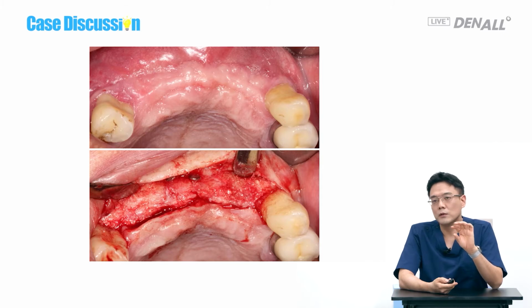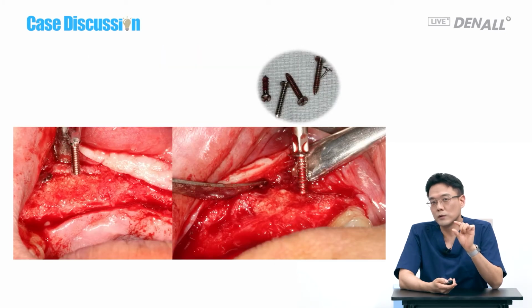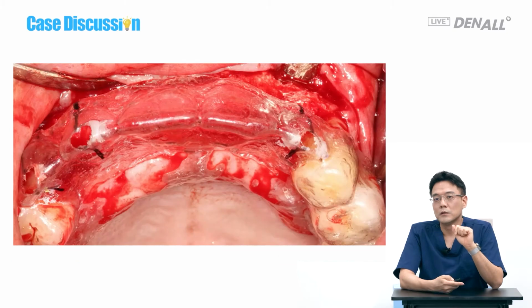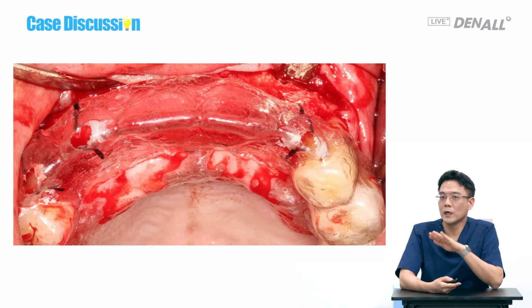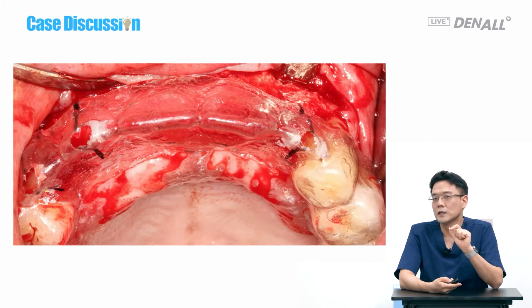I believe I waited for about 5 months, and it is opened again. You can see the bone formation. The screws are removed, so it is augmented 1 centimeter upward. If you look at the surgical stent made for the final prosthesis, still the bone is very deficient.